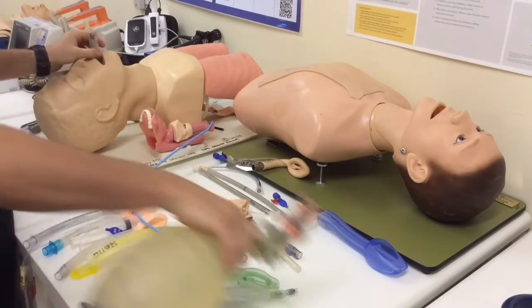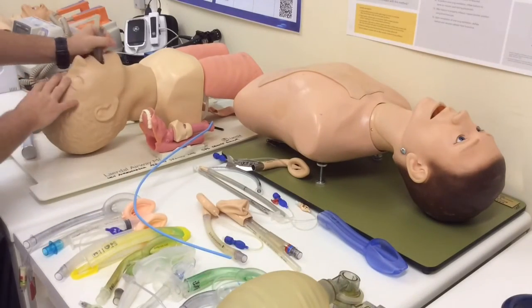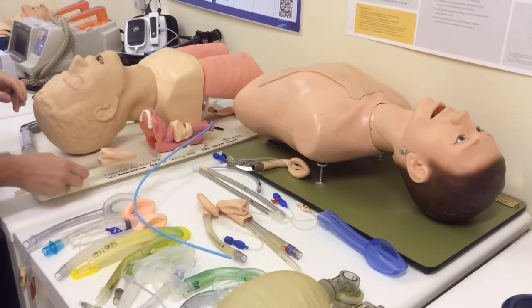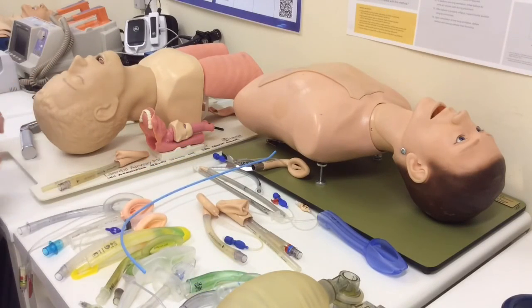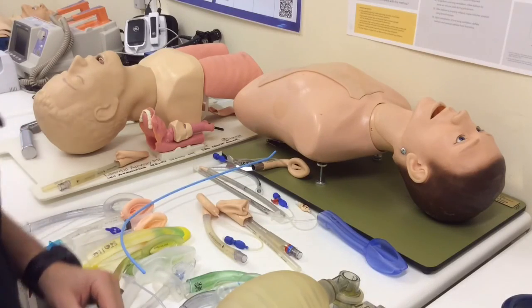In fact, studies have shown that this improves your insertion success rate and improves your sealing pressures. So that's the Brimacombe technique for using a bougie or an introducer to aid you with your placement of a supraglottic airway.